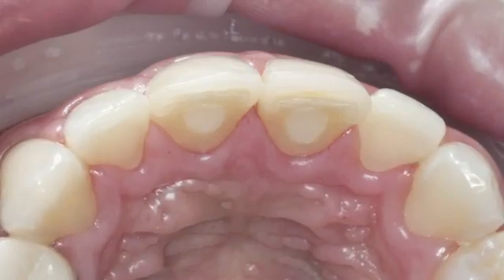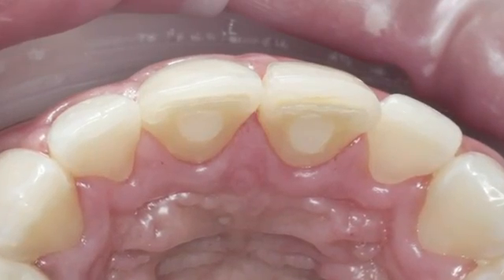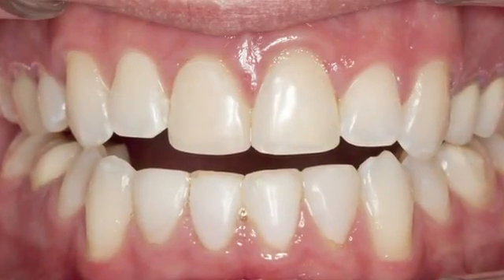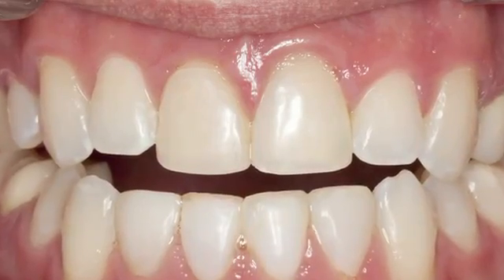This Edelweiss composite veneer procedure was performed on the non-vital incisals to repair the occlusal line as a result of trauma, the receding gingival crest of the previously placed composite, and to ensure longer term color stability.